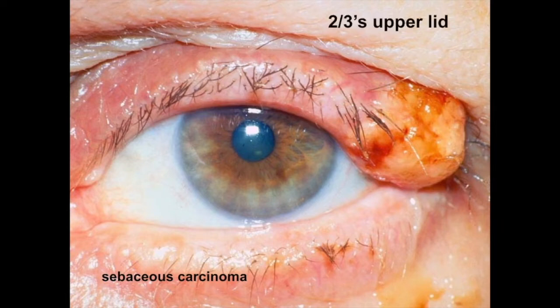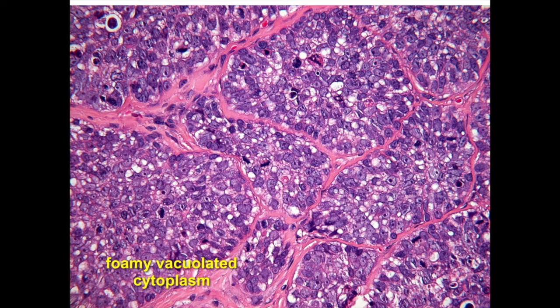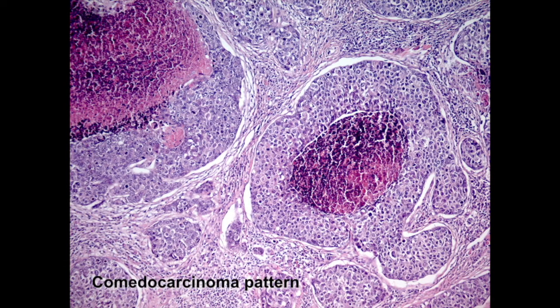Here's a sebaceous carcinoma, again, involving the upper eyelid. It does have sort of a yellowish appearance. This tends to be very protean in its appearance. Histopathologically, the tumor cells of sebaceous carcinoma classically have foamy, vacuolated cytoplasm. Of course, there are variations in the degree of sebaceous differentiation. Note that there's no peripheral palisading here. Larger tumor lobules undergo central necrosis, and this is called the comedocarcinoma pattern.